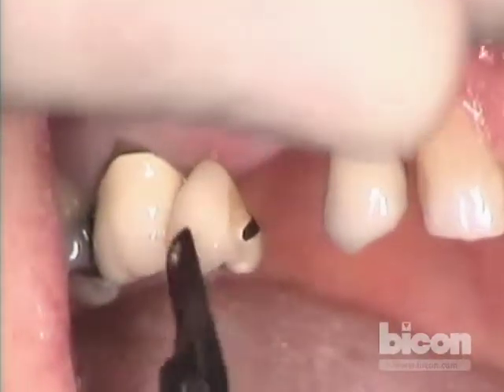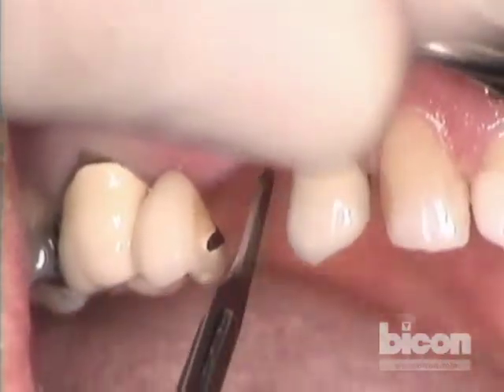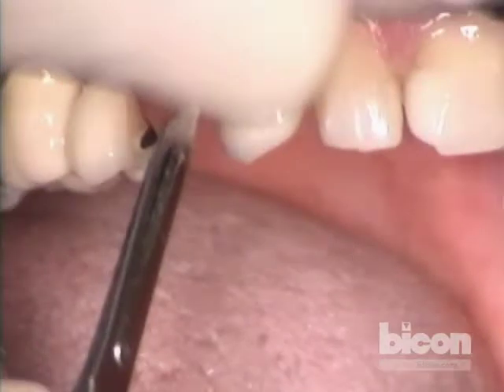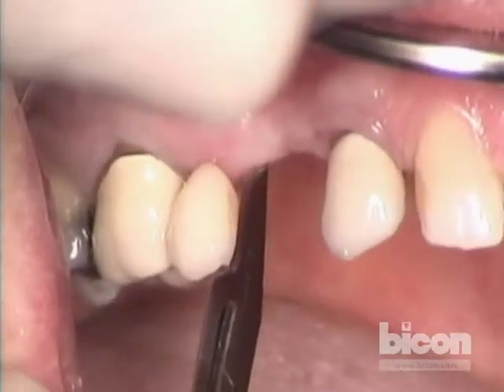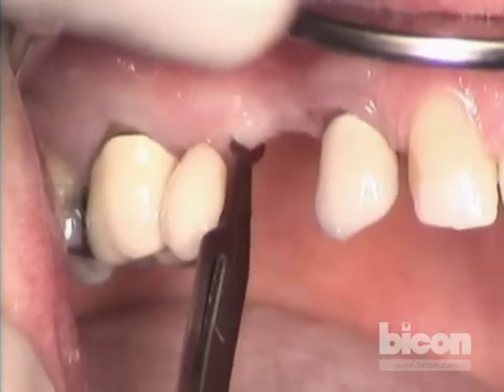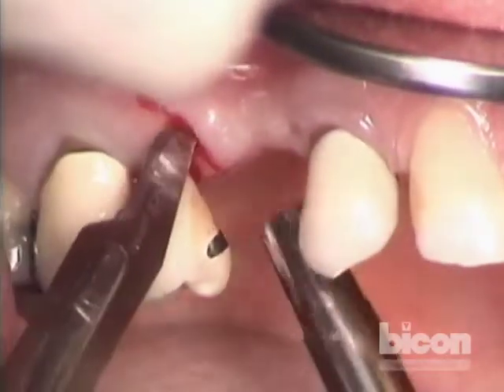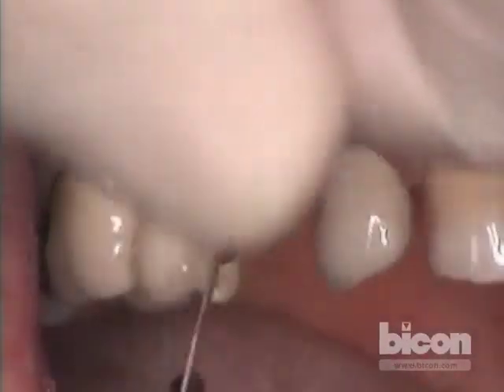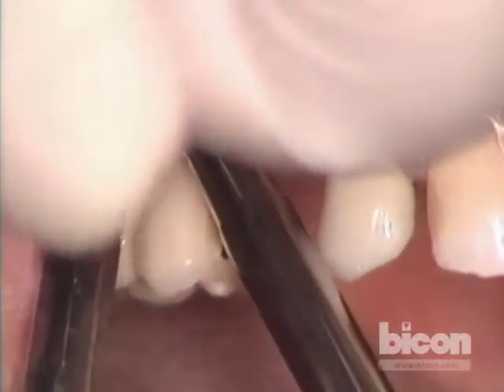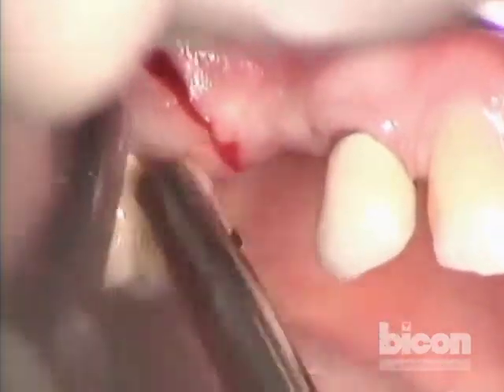The design of the flap and incision will be a paddle-shaped design that will go from the crest with papilla-sparing incisions mesially and distally. So what we'll do is start this incision right there. Do you feel anything? Suction, please. And we'll have a little beveled incision, and we will carry it on up, and make it right straight through the periosteum.